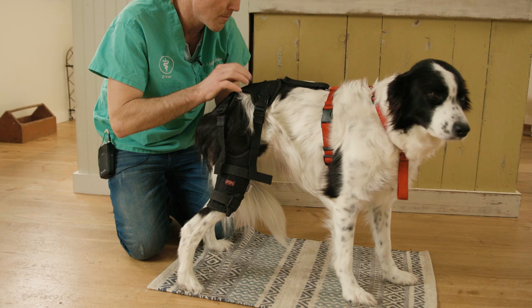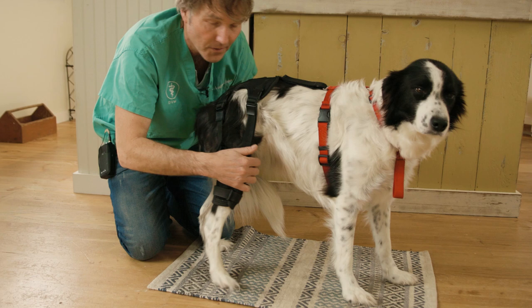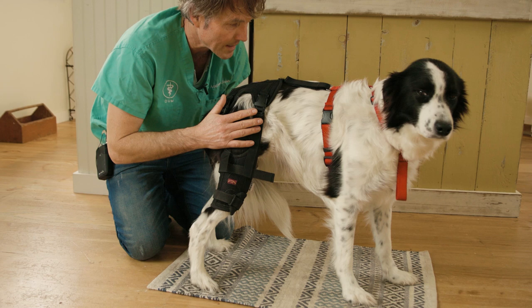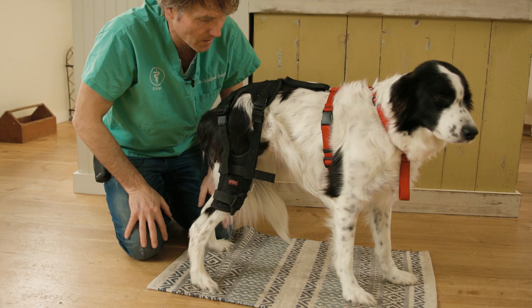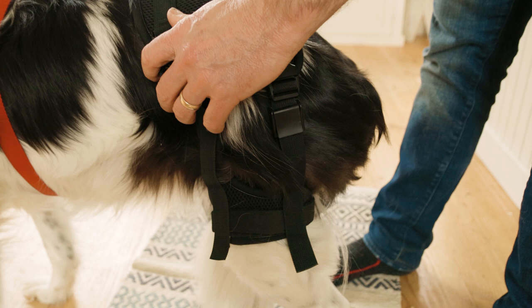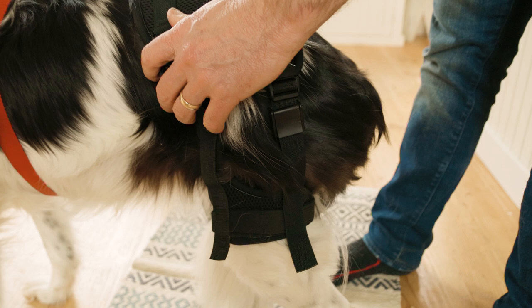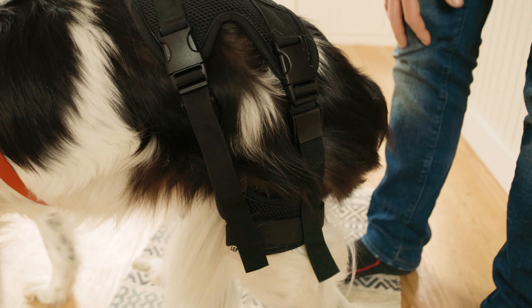Make sure the Ortho Dog label on the back support is quite centered. Slowly adjust, pulling down on these fabric tabs to snug it up, so we've got moderate pressure on the right and the left leg. It's called a non-rigid ACL support brace, and I think it does a really good job of helping with some of the biomechanics and helping a dog like Heather heal without having surgery.